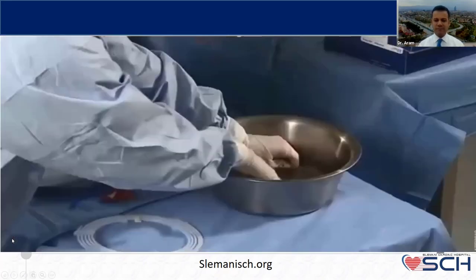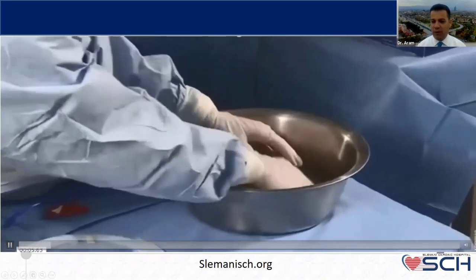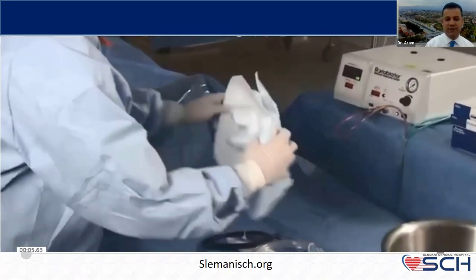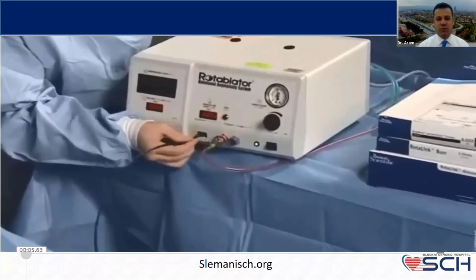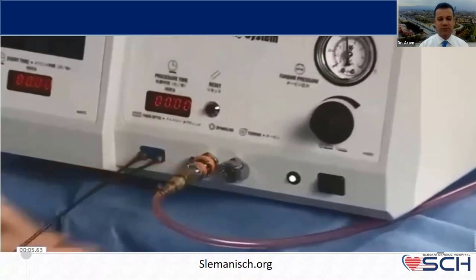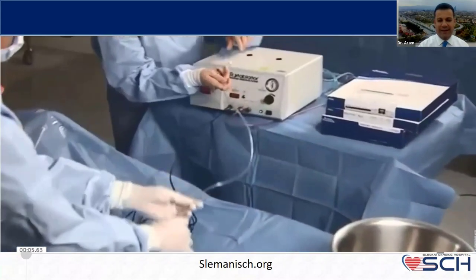Later on, after preparing the gas tank and the console, we are going to take the wire. As we said, we have two types of wire: the RotaWire floppy and extra support. After crossing the wire to the lesion, we are going to attach the advancer to the console, which is the hardware of the machine. This port is for the gas tank.